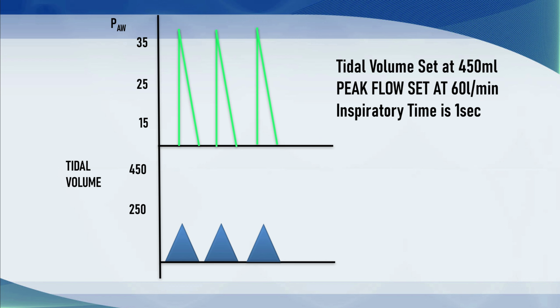The alarm starts honking as if there was an air raid, and everybody starts to freak out. And people start pushing buttons on the ventilator. Often 2 or 3 people arrive on the scene and start fiddling with it and flipping around modes and doing all kinds of crazy stuff. It gets worse if any of the doctors start doing this because they're usually clueless about what they're doing. And eventually someone changes the mode of ventilation and it all settles down and they all go, well, we're never using that mode again because it's kind of scary what happened.